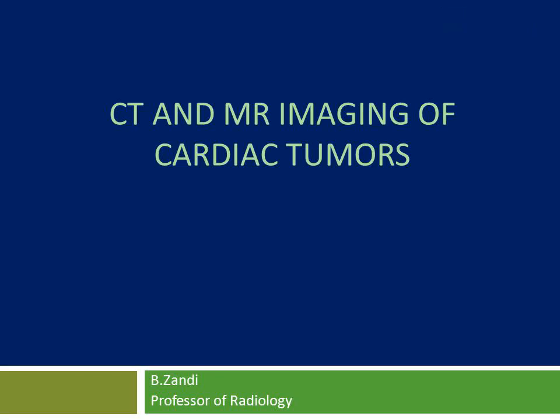CT and MR imaging of cardiac tumors. B. Zandi, Professor of Radiology.